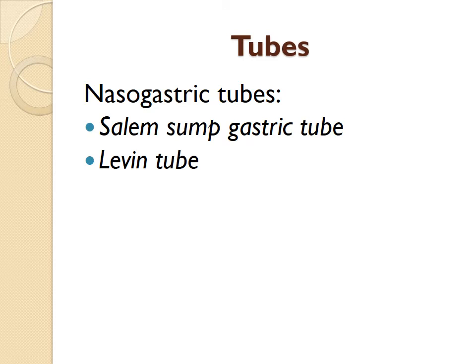So therefore, it allows for movement in the stomach cavity, in the stomach organ, for the bottom of that tube, so that it never sticks to the stomach wall.